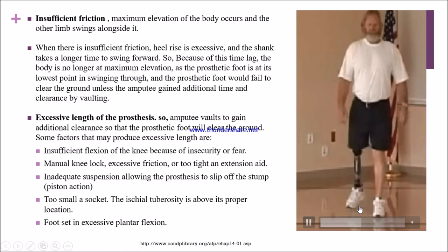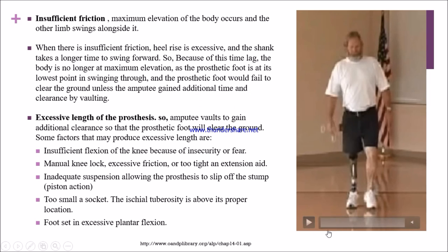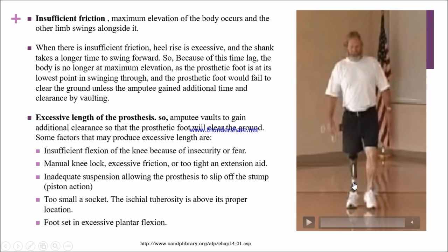In this video, we can see that heel rise is excessive and the shank takes a longer time to swing forward, causing a time lag. The body is no longer at maximum elevation, so the prosthetic foot is at its lowest point during swing. The prosthetic foot would fail to clear the ground unless the amputee gains additional time, which is why they vault. If excessive prosthesis length is present, the amputee again vaults to gain additional clearance.